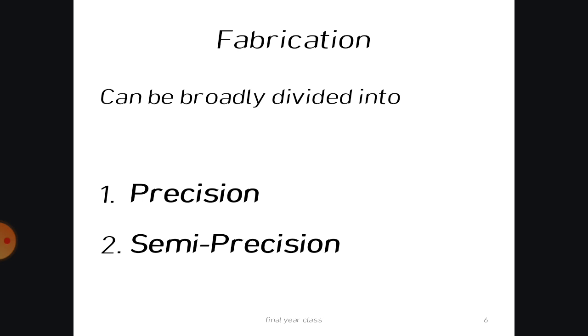The thing which you have to remember is in precision attachment, the components, that is the male part and female part, are machined. It is not waxed up, and we are not creating that part. It has been machined. So you know, when a material is machined, the precision of that machined part will be very close to accuracy. That means you don't have any deviation. The term is tolerance. The tolerance will be very less. That means you don't have any changes.